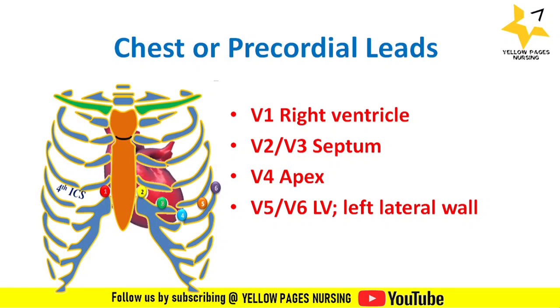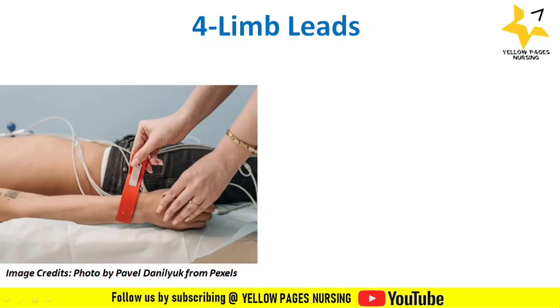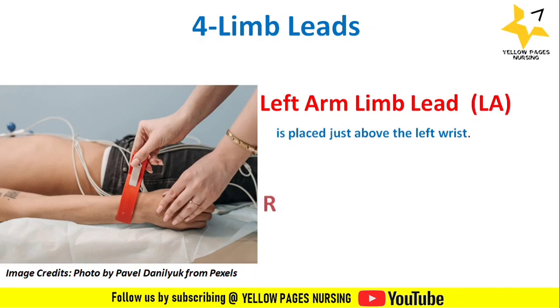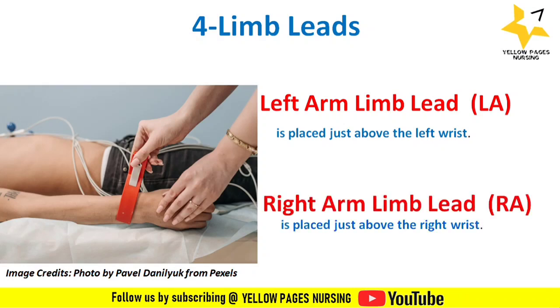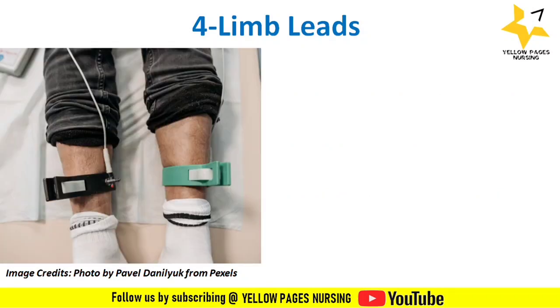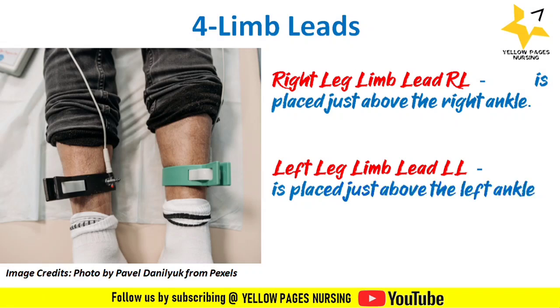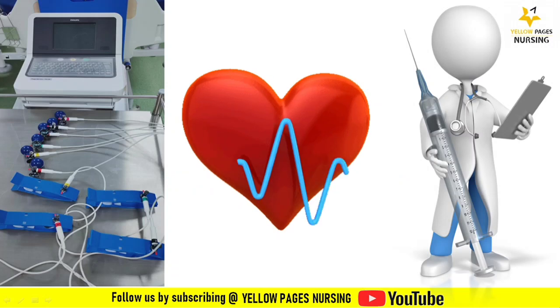For limb leads: the LA lead is placed just above the left wrist, the RA lead just above the right wrist, and the RL lead just above the right ankle. Remember to apply gel before attaching these leads, as it acts as a coupling between the electrodes and skin to aid transmission of electrical activity.